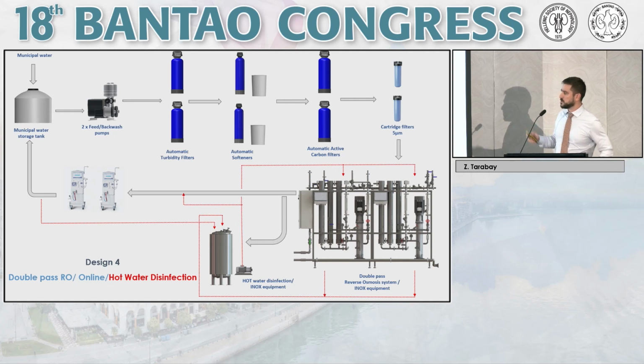So the general process is that, very simply, when we're comparing it in relation to the chemical disinfection, with the press of one button, the operator and the biomed technician just chooses what type of disinfection he wants to perform. So this could be the distribution ring, the RO, or both together. By the press of one button, purified water enters the hot water disinfection tank.